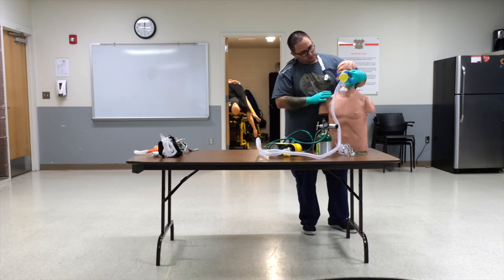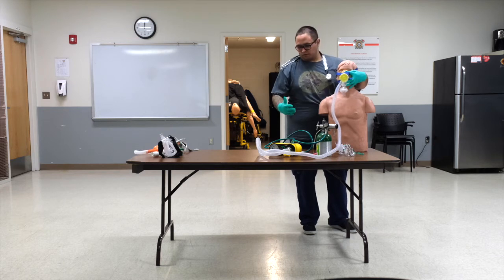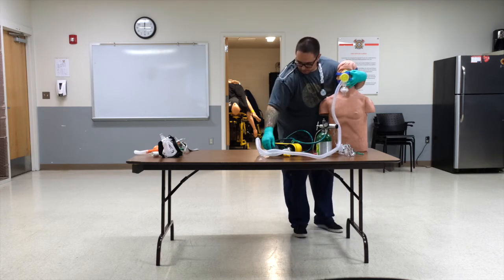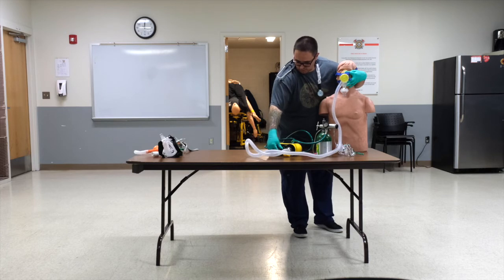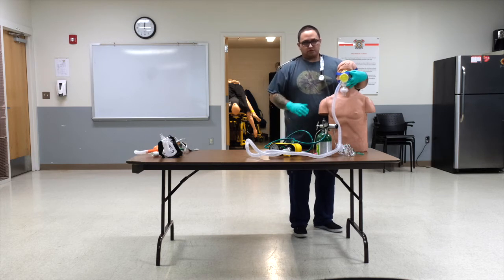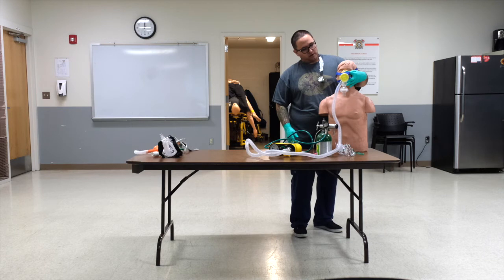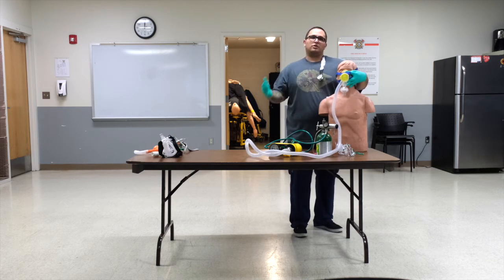So once it's fully secure, again, we're going to reassess how the patient is tolerating the therapy. We're also going to set this little dial that's on the machine to about 5 centimeters of H2O, and that is considered 5 PEEP, and that is our starting point. Reassess our patient, see how they're doing. We want to reassess their lung sounds. We want to reassess all their vitals. If they are tolerating it fine, and the machine is secure, this is the point that we would probably get them onto the gurney if we haven't already done so and initiate transport.